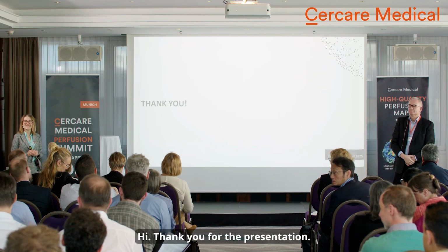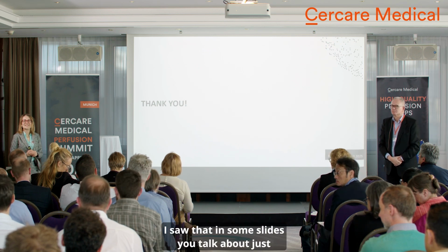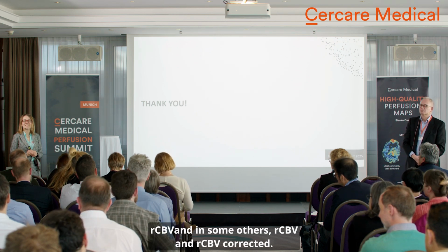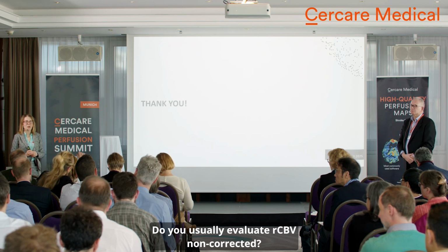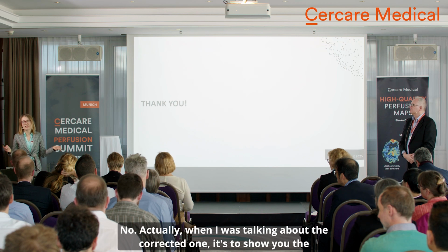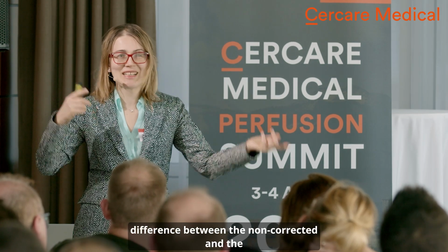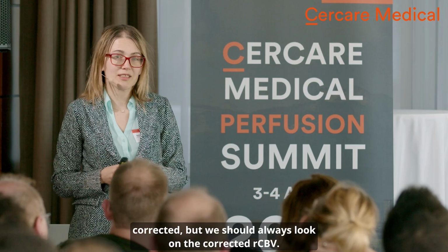Hi, thank you for the presentation. I saw that in some slides you talk about just rCBV, and in some others rCBV and rCBV corrected. Do you usually evaluate non-corrected rCBV? No, actually, when I was talking about the corrected one, it was to show you the difference between the non-corrected and the corrected. But yes, we should always look at the corrected rCBV.